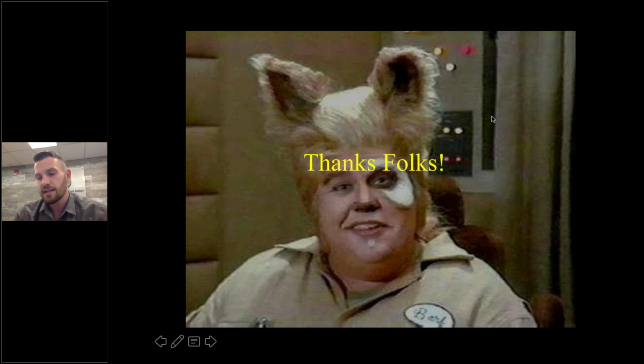So you can utilize that tacking instrument to create the pilot hole, but really I use that membrane holding device to both create the pilot hole as well as to hold it in place while I'm putting the tacks in. Typically when I do that, I will get it where I want it, and my assistant will then grab the membrane tacking device, hold it in place, and I will tack.